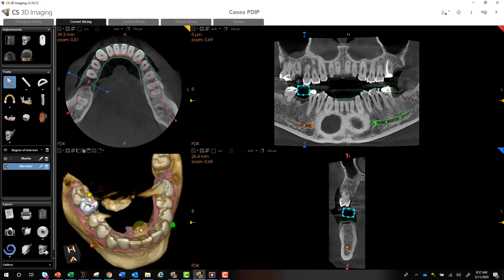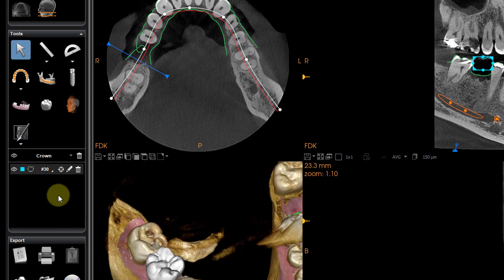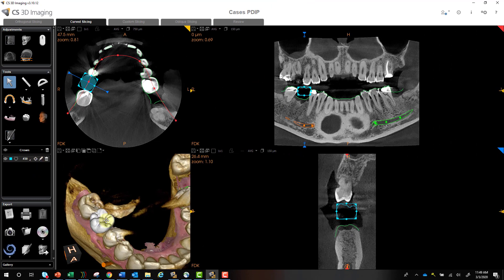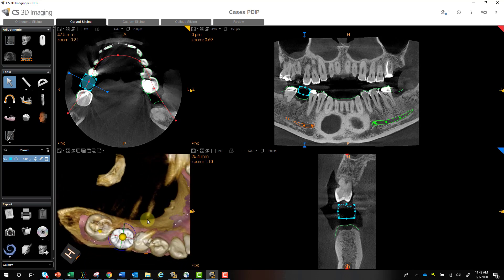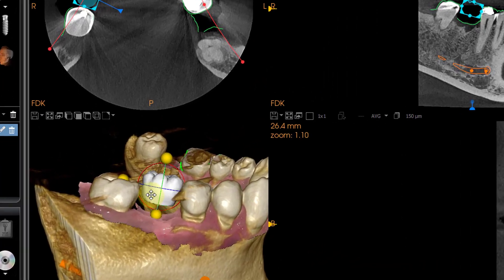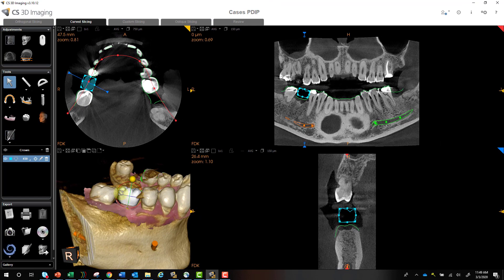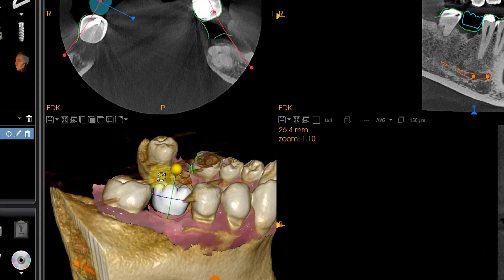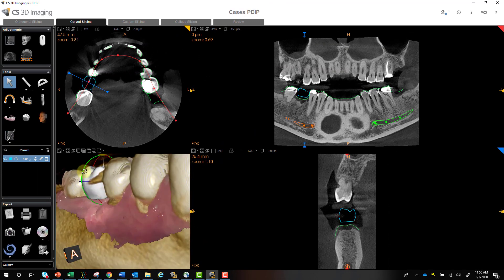In this particular case, now I can go ahead and see my crown. When we go to our object area, we can select our crown and this little icon will center all of my views on that crown. I can click on the 3D rendering of the crown to visualize and manipulate exactly how I want. These yellow nodes will increase or decrease the crown in all dimensions. I can grab any of these little colored areas to center and turn it. When I have the four arrows on the crown, that's where I can actually move the whole crown — more of a bodily movement. When I see the two arrows, I'm attached to one of the movement handles to turn it — for example, on the green handle I'm tilting it.